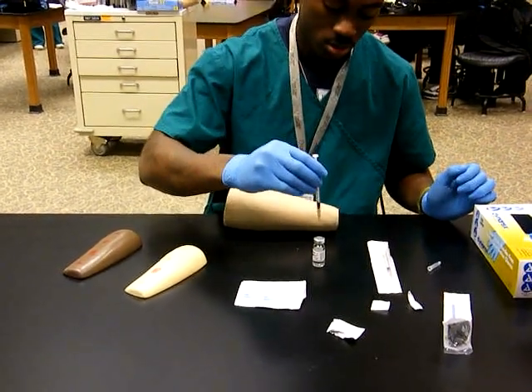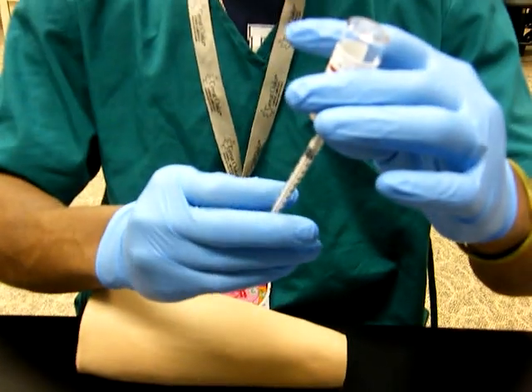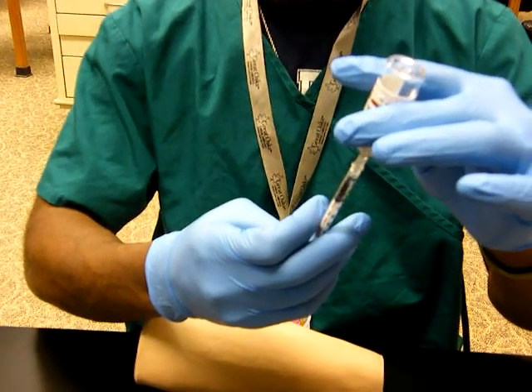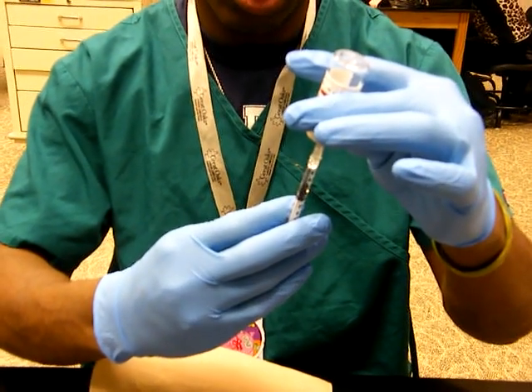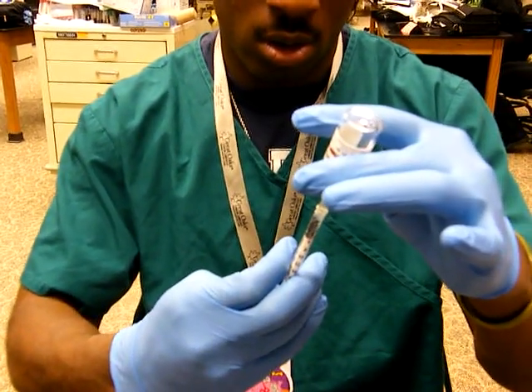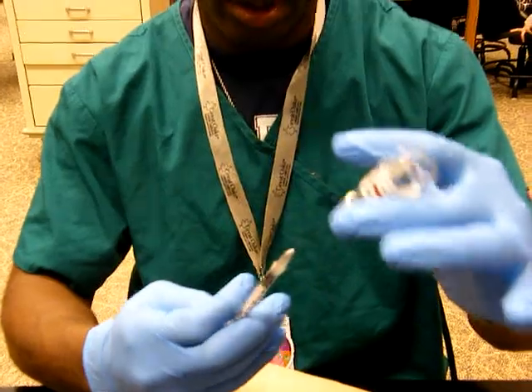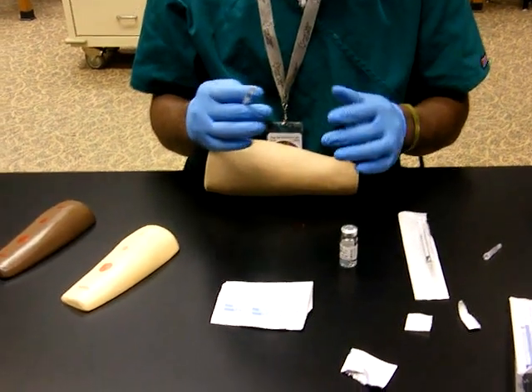Take your hand away, remove your hand. Stick it in. Push the air inside. Pull back to how much you are needing. Now, if you have air inside of it, you want to pull back a little bit more. Make sure your needle is not above the liquid where you are putting air in it. Push up to push the air back out to how much you need. Then you pull back, still making sure that it's the right measurement of what you need.